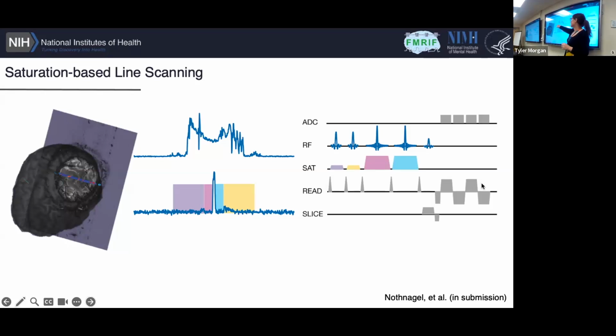And this might have a profile that looks like this, where you can see a lot of brain in here. With the saturation pulses in place, you can essentially leave just a tiny bit of the image in the middle, but cancel out everything else. Now we don't have nearly as big of a problem. Think about it: if the entire image is all collapsed into one line, it's not a big deal because it's only a tiny sliver of image anyway.